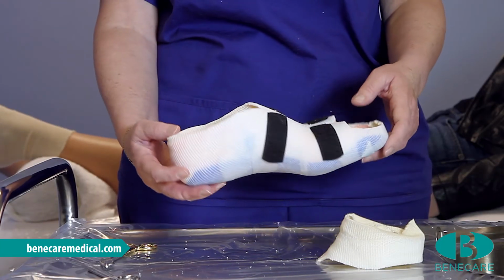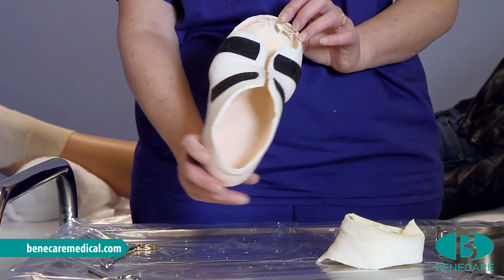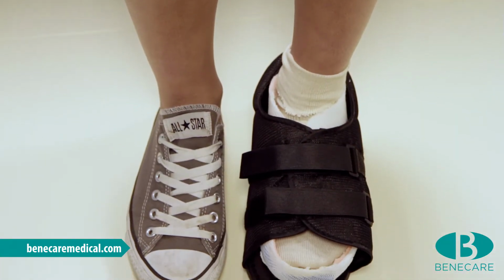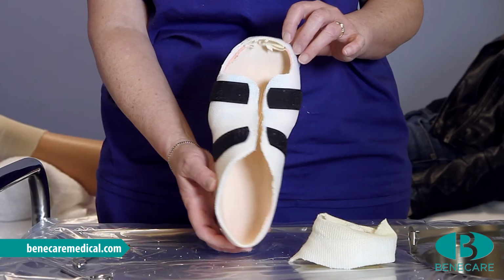Today, I am going to apply a slipper using Benecast Flex semi-rigid casting material. This application is suitable for offloading diabetic foot ulcers, metatarsal fractures and post-foot surgery.